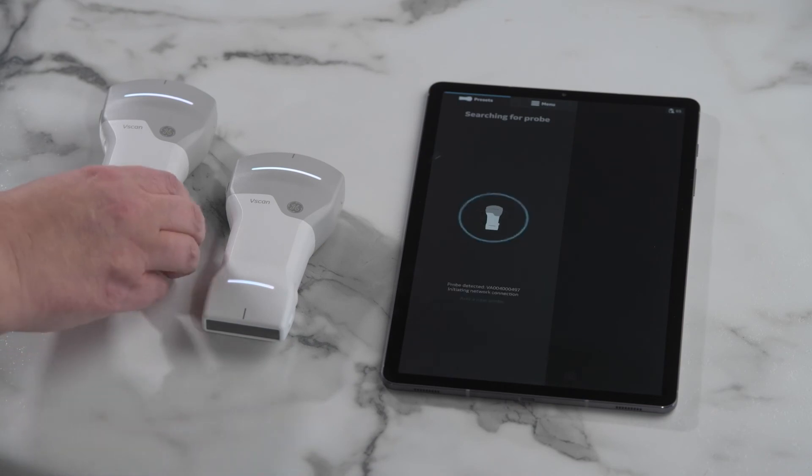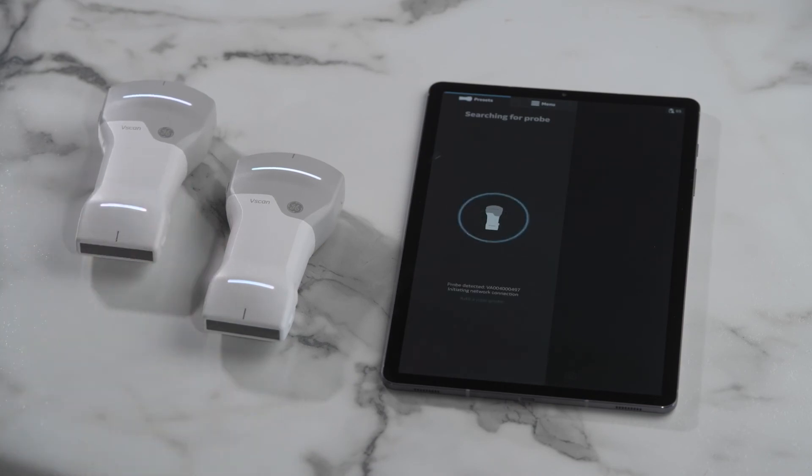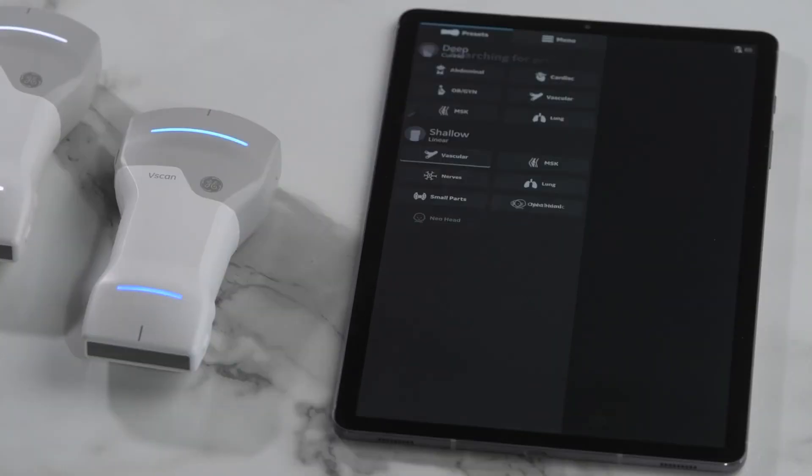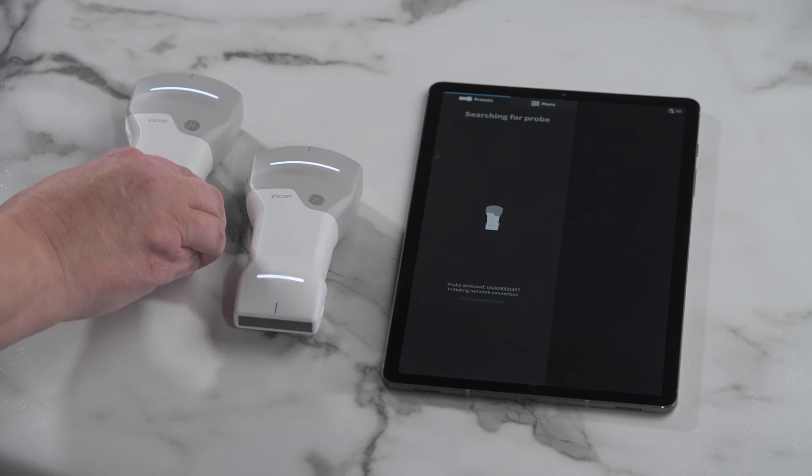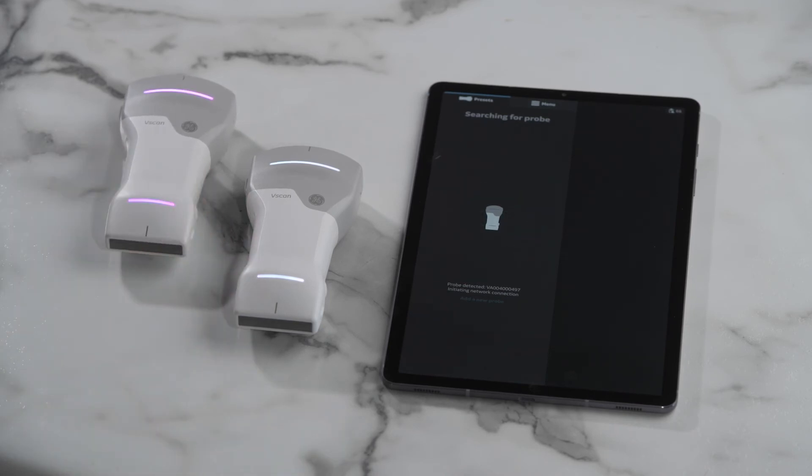If there are multiple probes available near the display device with the app, the closest probe will be detected. If you need to pair with a specific device, turn off the others or remove them from the vicinity of the app.